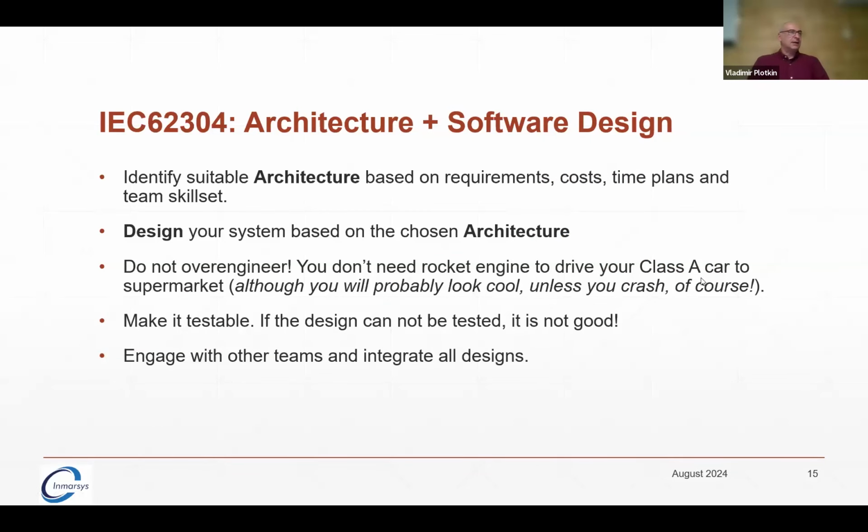Right, so architecture. Once you go into the architecture design, you need to think how you're going to be partitioning your system. So you have the software items, you have the software units, you have software systems as well. At the very beginning you probably do not have the complete architecture, so architecture will evolve, but you have a rough understanding of how the system should be working.